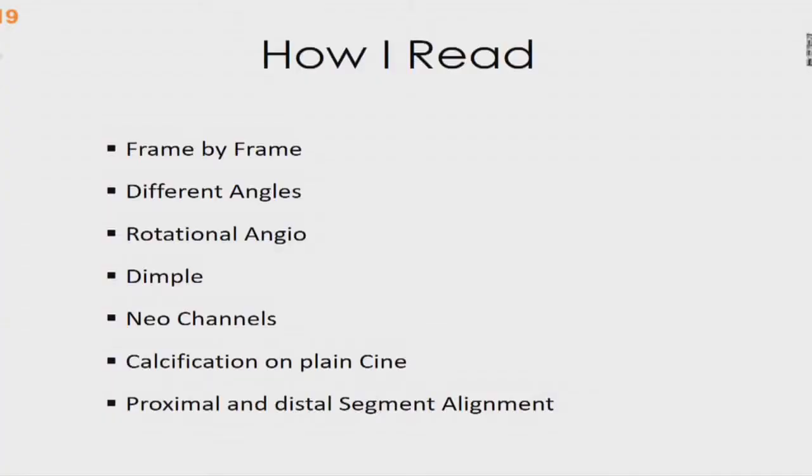Good afternoon. Yes, there will be some overlap of the information in the lectures because the CTO PCI basics contain many overlaps. First and most important thing is how you read the angiogram, how many times you read the angiogram yourself. Maybe the interpersonal assessment and intrapersonal, same doctor assessing at different times. Yes, your decision will change. The collaterals you choose will change. This happens in real practice.